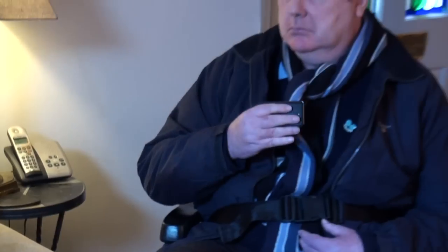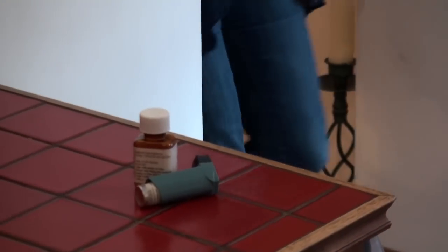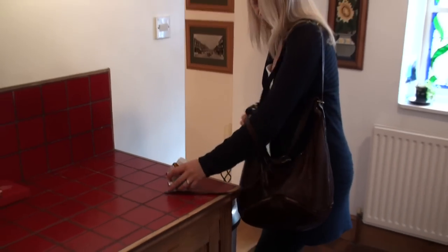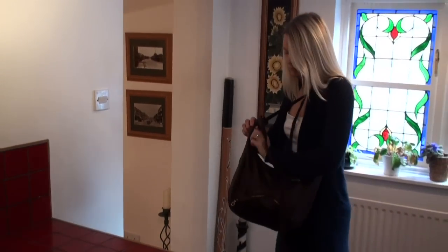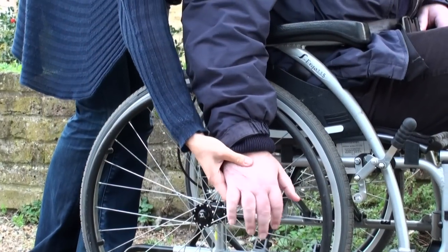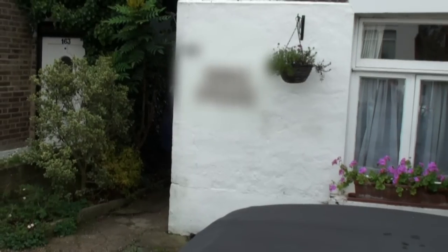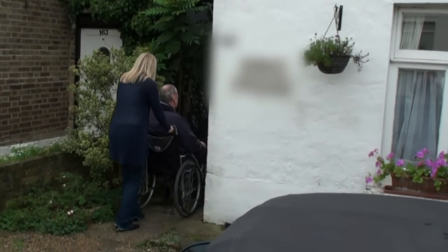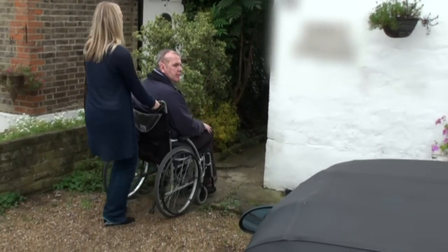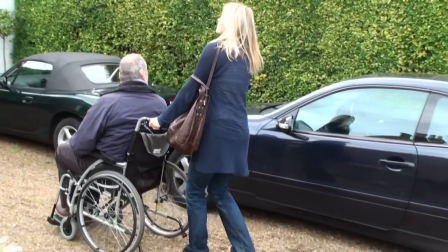If you have a mobile, it may be a good idea to take it just in case of an emergency. It is also wise to take any medication with you, just in case. Before you start to move, make sure the hands are resting safely on the lap and not hanging down so that they may get caught in the wheels. Here's a tip when pushing a chair over gravel: wheel the chair backwards, allowing the bigger wheels to run smoothly over the stones.